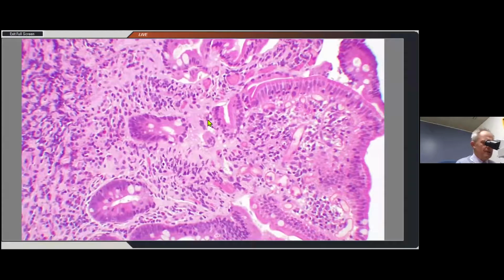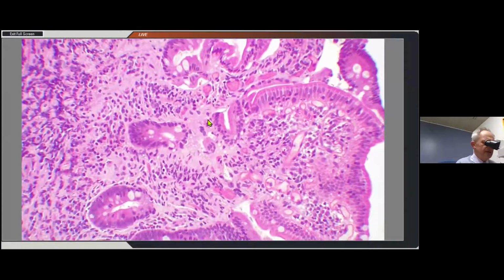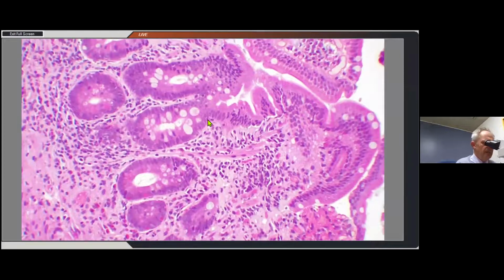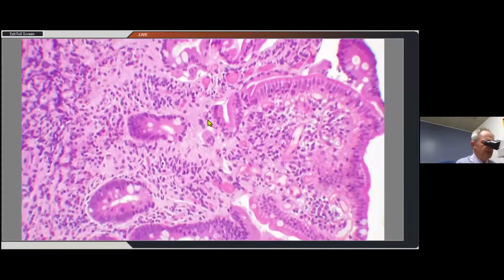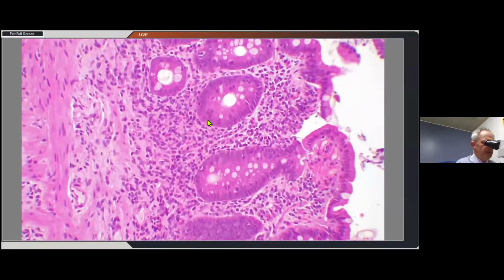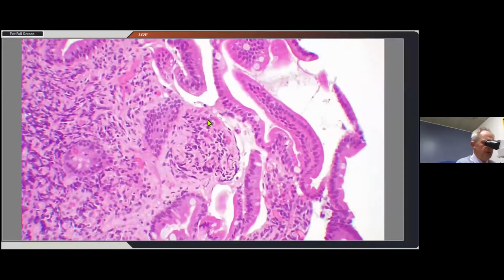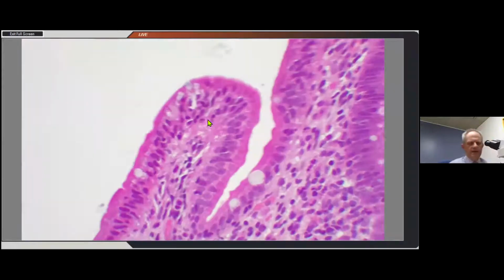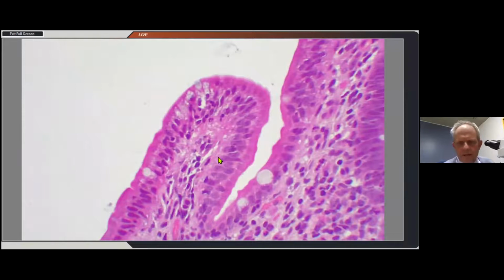Typically what happens with active chronic duodenitis is you do get atrophy of the mucosa. So that's a good example. What I'd like you to do is remember the photograph, park that away in your mind, these neutrophils, and then we'll discuss the next case.